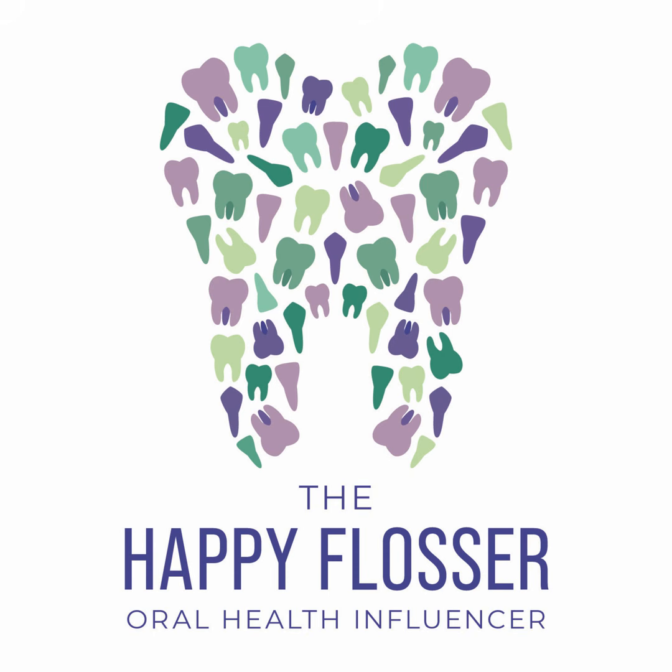Then you have fat, right? So we're going through fatty tissue when we are taking an image of our patient. And then you have water, that's kind of in the middle, right? So if you're doing those science experiments back in elementary school, the water is the middle of the densities, and there's things that are less dense than water and more dense than water.